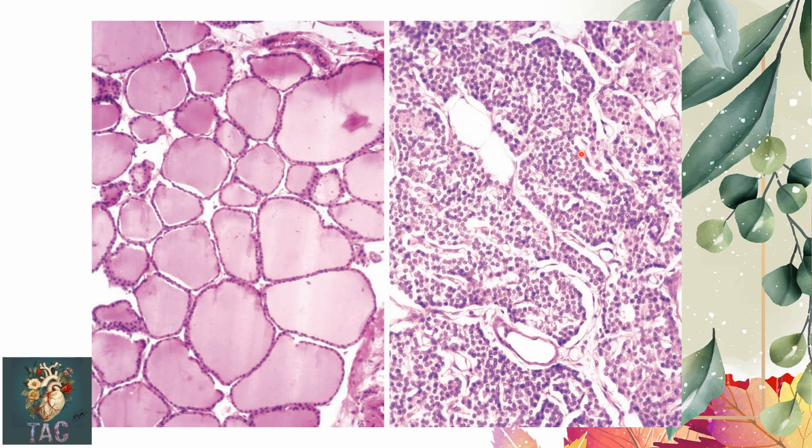Here you can see a large number of principal cells, and scattered in between them, singly or sometimes in clusters, are the larger rounded cells which show strong eosinophilia; these are the oxyphil cells. Among these cells, a large number of fenestrated capillaries are also present, which is a feature of all endocrine glands. Here you can also appreciate the larger amount of blood vessels.